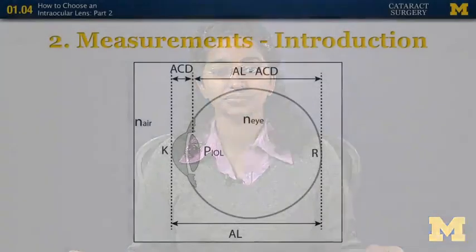This complication happens to be one of the more common malpractice claims for ophthalmology. We use different safety checkpoints to avoid this error, including marking the eye, timeouts, and having only one patient's information or IOL in the OR at a time. The starting point to verify correct information is your calc sheet. So train your brain to always first assess the identifying data before moving on to looking at the numbers.